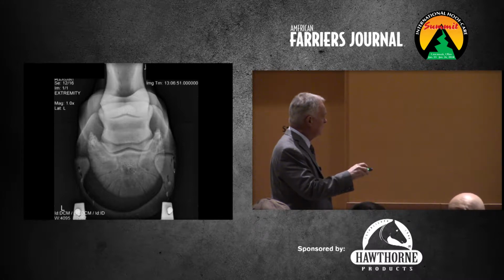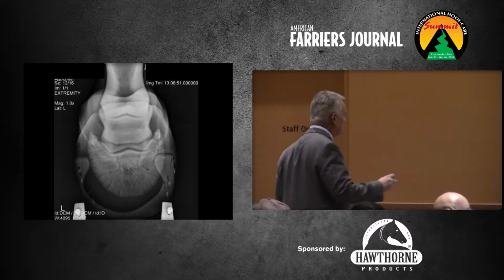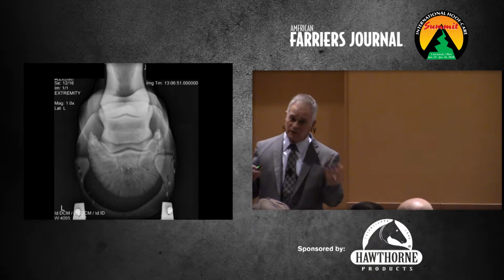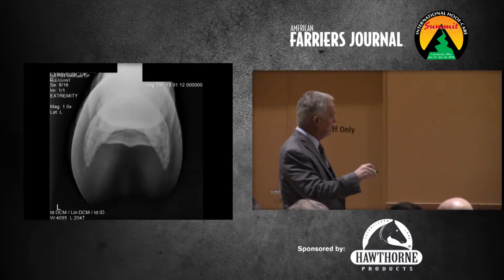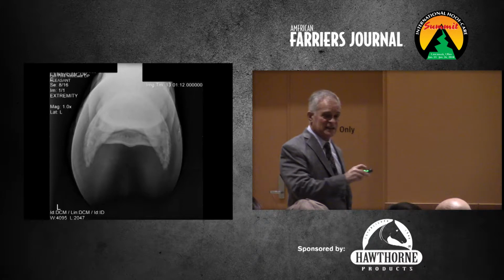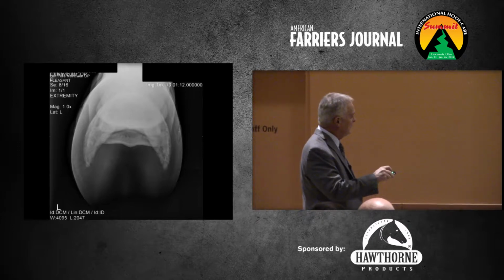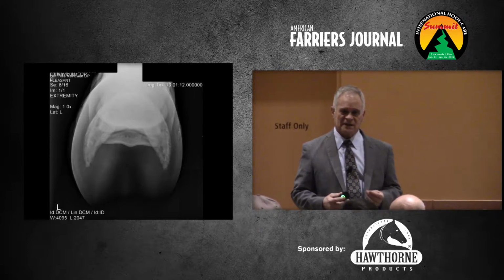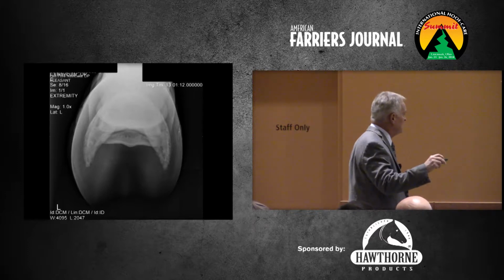That's our navicular bone. And I could say there's some modeling of that navicular bone, some mild modeling, maybe a mild increase in size or irregularity of those navicular bone distal border foramina. This is our flexor view, where we're shooting down the back of the navicular bone. This is the surface where the deep digital flexor opposes, and that's very nice in this horse. We can look at the inside of the bone, and I can see those foramina, and I might comment there's a little bit of sclerosis or reduced corticomedullary distinction in this horse. So I've done a little hedging on the navicular bone, but I haven't said anything really specific.